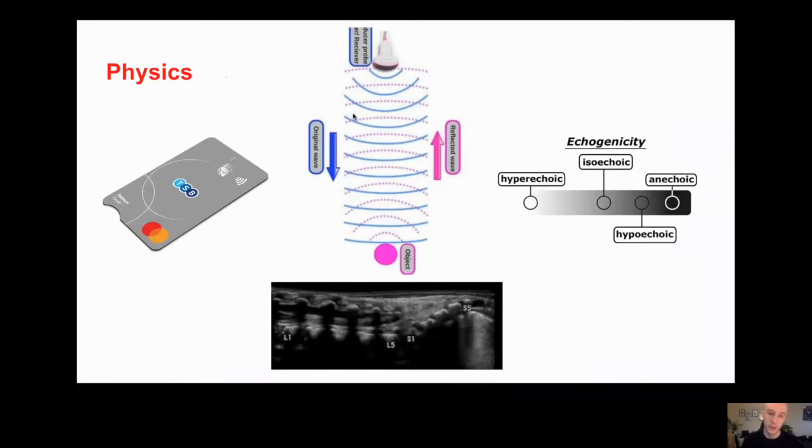And what is actually coming out of the ultrasound probe is a credit card thick beam. Okay, so this probe, we're going to go over different types of probe in a second, is curved like that, and it's coming out like that. But in terms of on the side, it's only a credit card thick. So when I think about what image I am seeing, I think about just chopping through the thing that I'm imaging, and that's what I would see, the 2D section.